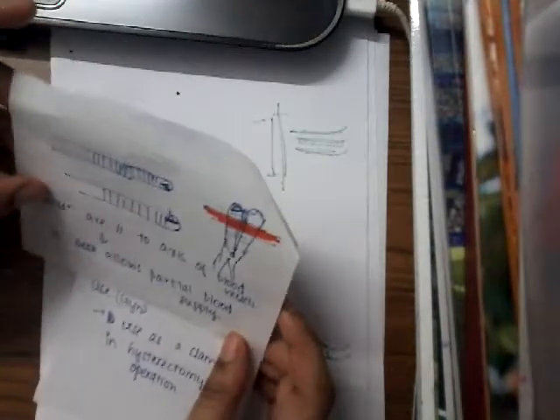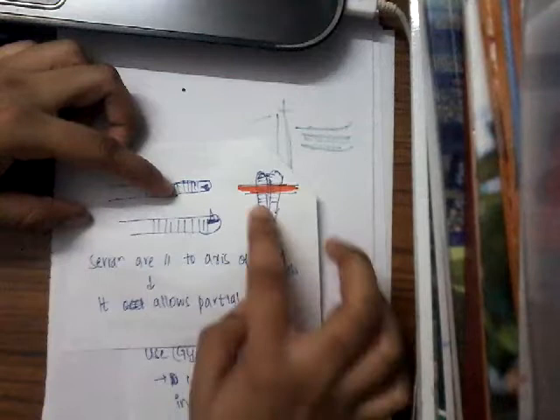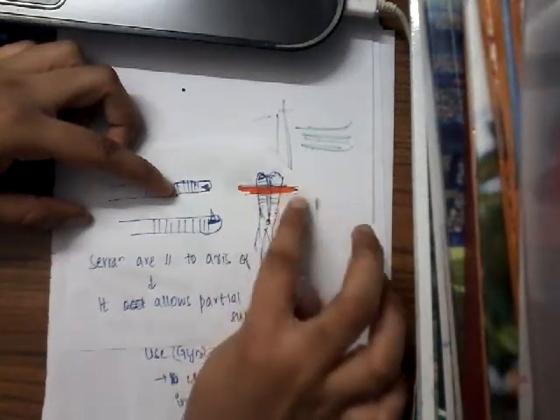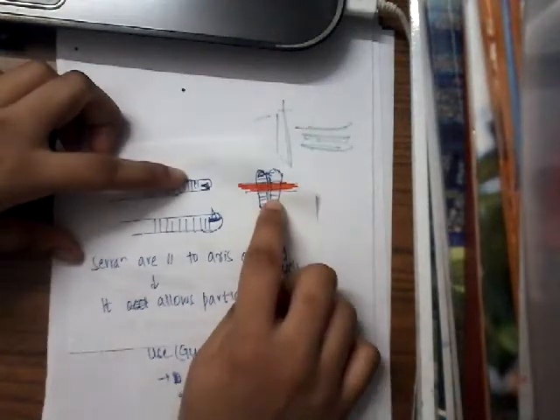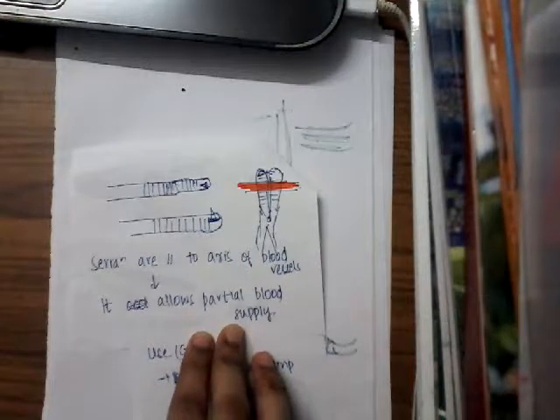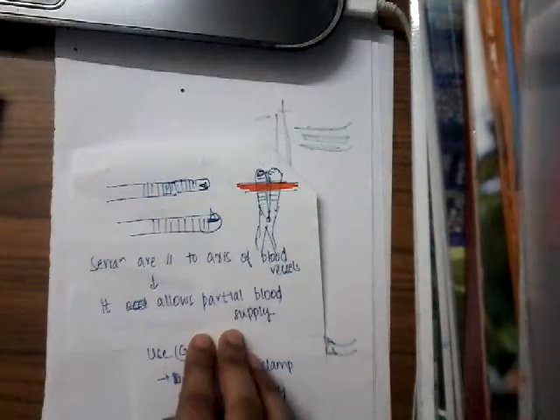In Kocher's artery forceps, this is mainly used for holding the arteries. The serrations of this Kocher's forceps are horizontal, so they are parallel to the axis of blood vessels. As a result, it will not allow complete obstruction of blood supply — it just partially occludes the blood vessels. So as a result, it can be used for hemostasis.